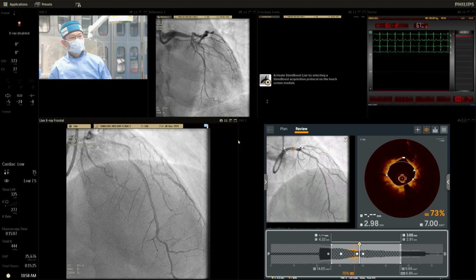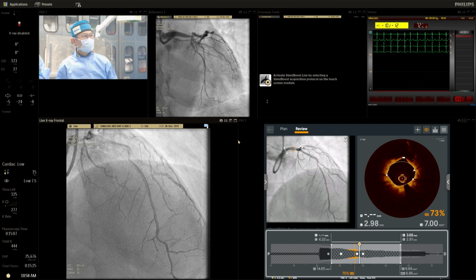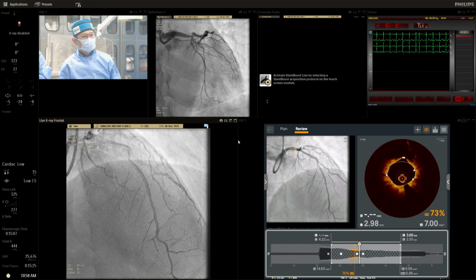In any case, those things are what you can achieve safely, and they've achieved an excellent result. Angiographically, I think we should ignore it. The more imaging you do, the more trust there is in the imaging. Don't look at the angiogram that much. It looks so fantastic in the other views, very eccentric, and the area you've achieved is excellent. So I think that's reassuring. That is just an amazingly good result. It illustrated many different things in the case, which I think was very illustrative.